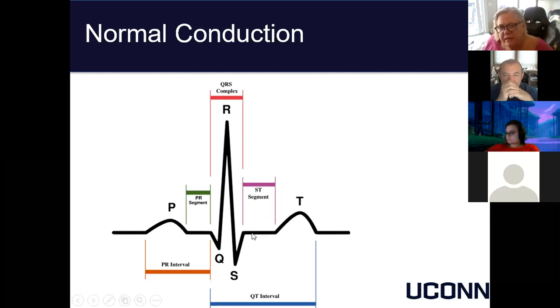I think that's the more important aspect of the ST segment. But PR interval, QRS width, and QT interval are very important timings when you're doing EKG assessment.